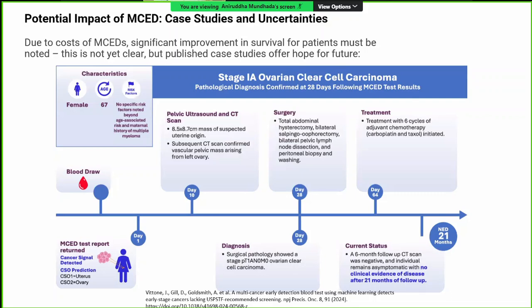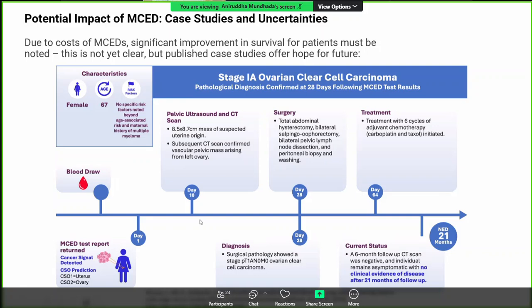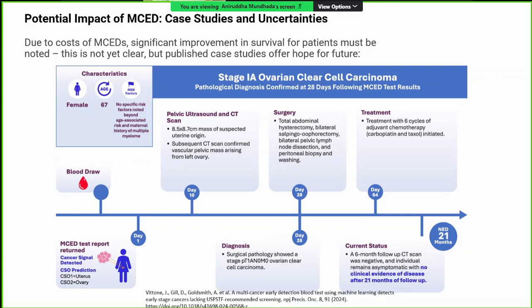Potential impact is basically we are trying to get a lead time before all the radiotherapy. So even at day 10 or day 30 after treatment, we can start looking at a relapse or detect a relapse, which in the current scenario is by imaging, and that needs a much greater mass to become positive as compared to ctDNA or liquid biopsy.